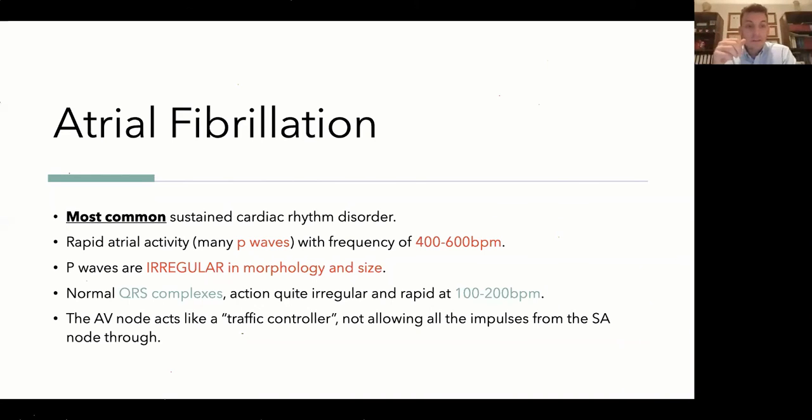Okay, but the QRS complexes will look fine. Why? Because the QRS complexes represent the function of the ventricles, and the problem is not at the ventricles, it's at the atria. Hence, it's called atrial fibrillation, okay? And now you ask, why do we care?